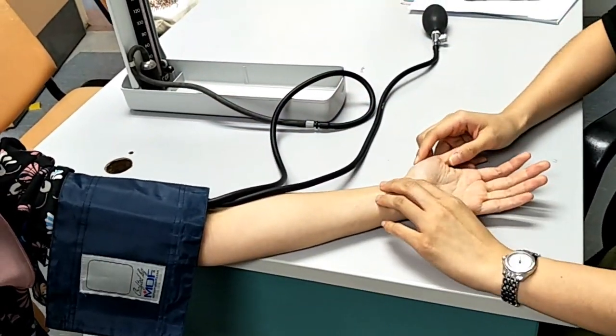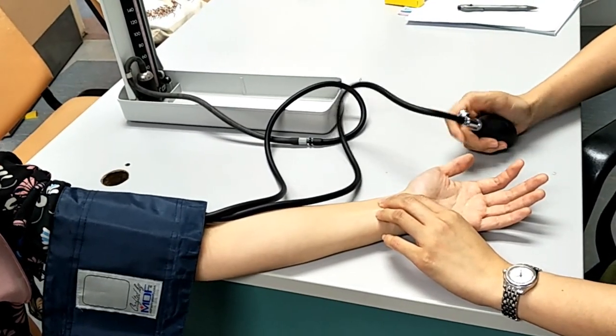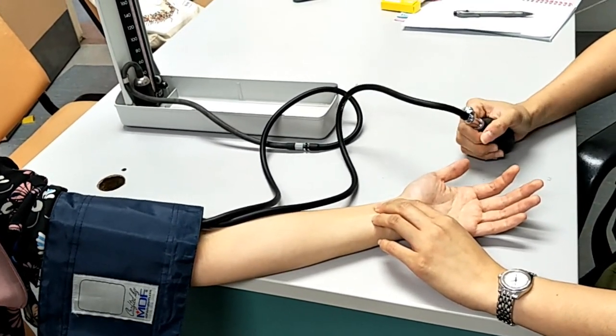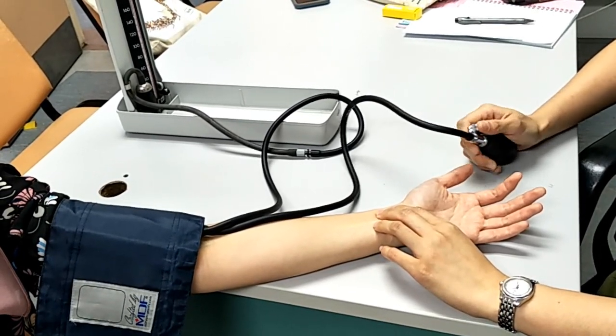Put two fingers on the wrist and feel for the radial pulse. Next, inflate the cuff until you could not feel the pulse anymore. That gives you an estimate of the systolic blood pressure. Once done, deflate the cuff.